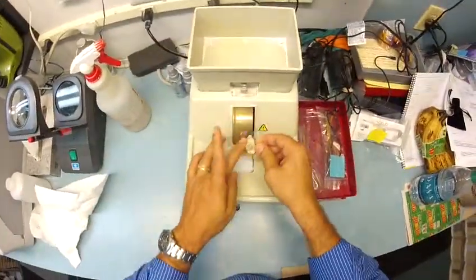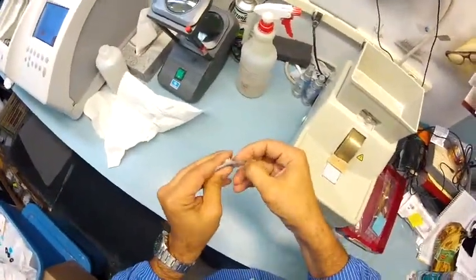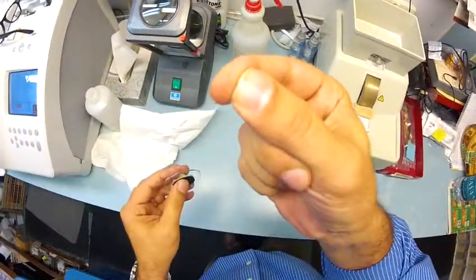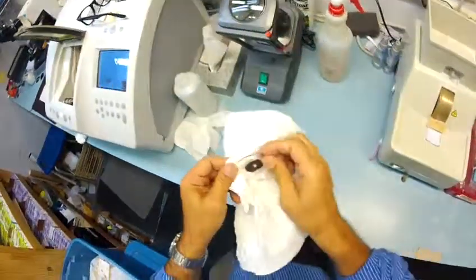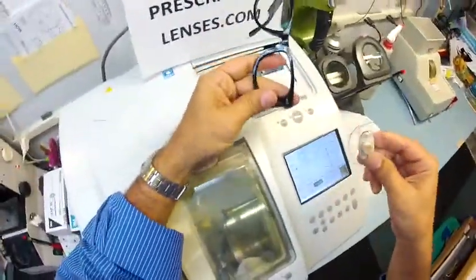Okay, back to the handstone real quick. To smooth out those rough edges. Use my thumbnail to scrape all that off. And I do this so much, I've worn a V-shaped bevel into my thumbnail. But once it's all on the counter, I wipe it on the floor. Whee! Hey, you know, the clown has to have fun while he's at work too. It's not all serious business.